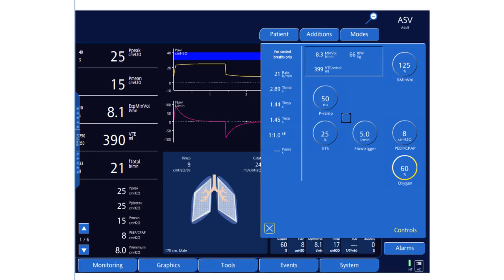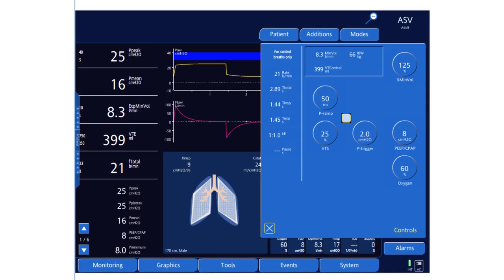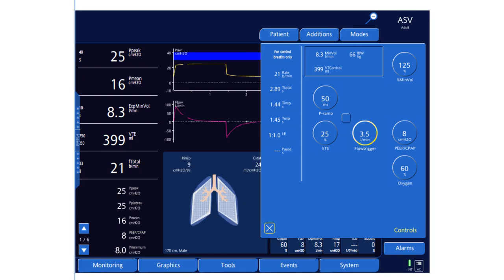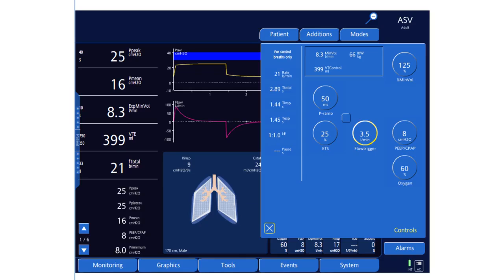The last two dials are applicable to spontaneous breathing. If the patient starts to breathe, he needs to generate a trigger to initiate a pressure support breath. You can choose pressure or flow trigger — let's set it at flow and go down to 3.5 liters per minute. The cycling mechanism is set at 25%, meaning the machine will release pressure once flow drops to 25% of the peak inspiratory flow during the volume support breath.